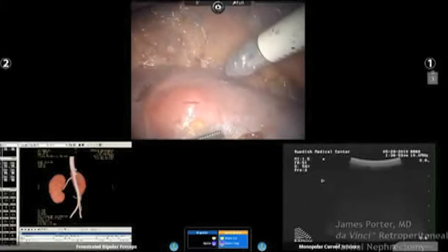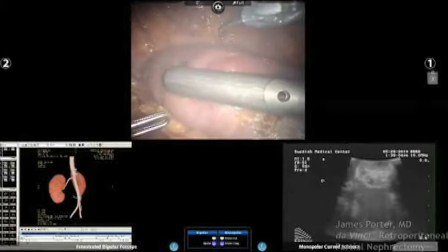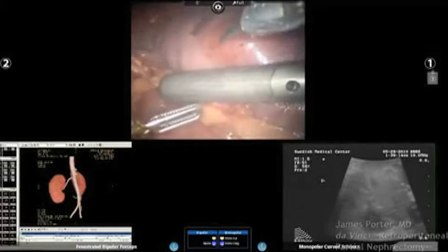I'm going to go a little wider than you would think. I mean, this tumor is deep, so we're going to have a little wider margin in order to get it out completely. That's it, Nance. Bring that down. Right there. Take them off. Okay, let's suck smoke.